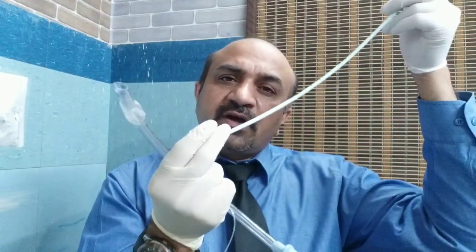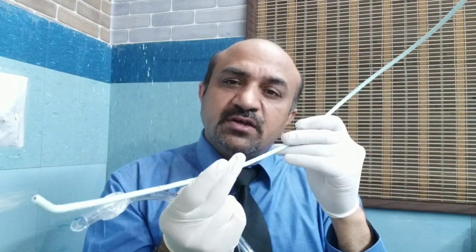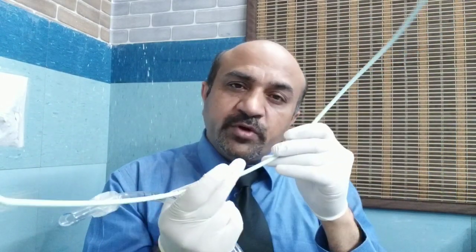With the help of the laryngoscope, which I'm going to demonstrate in a while, you can look at the trachea. Then under vision you can pass this bougie into the trachea, and go a little bit lower than that.